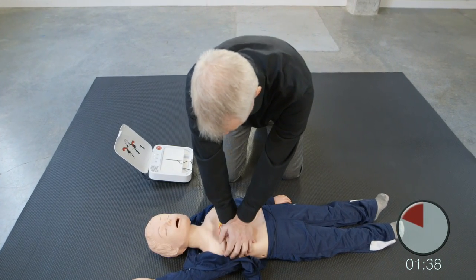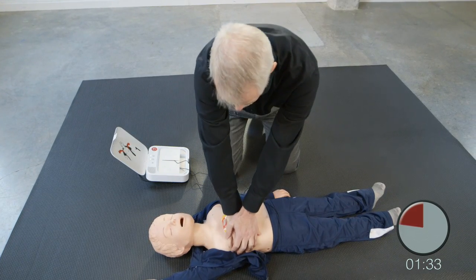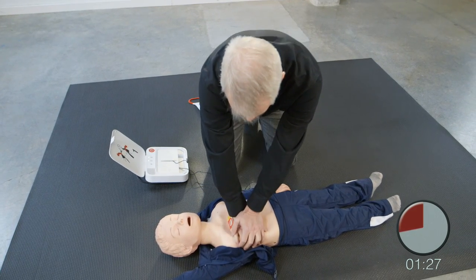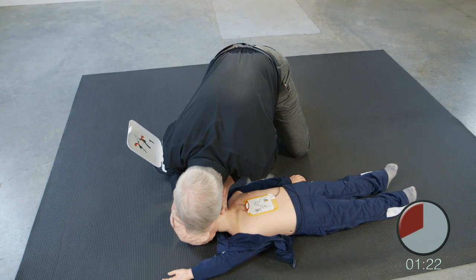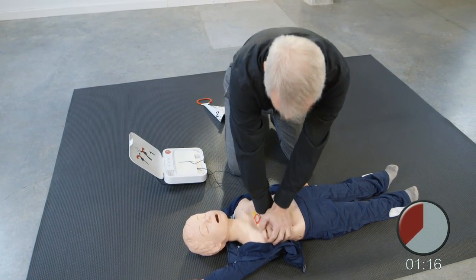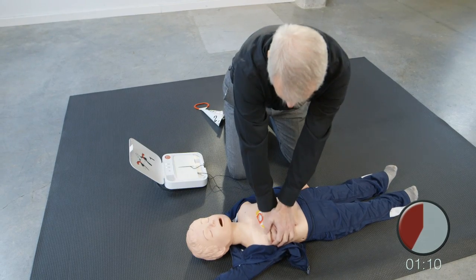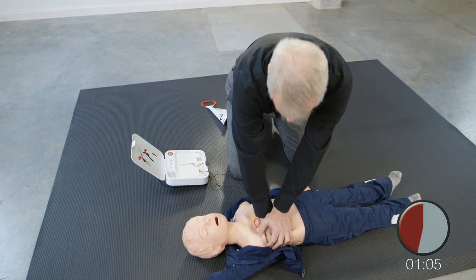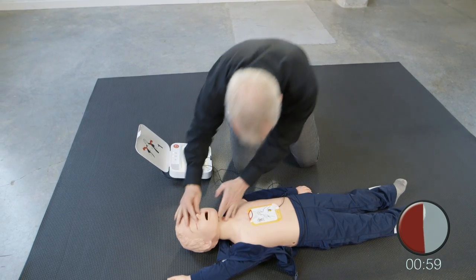Push down deep. Provide two breaths: 1, 2. Resume chest compressions. Push down deep. Provide two breaths: 1, 2. Resume chest compressions.